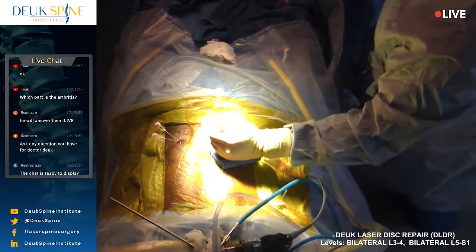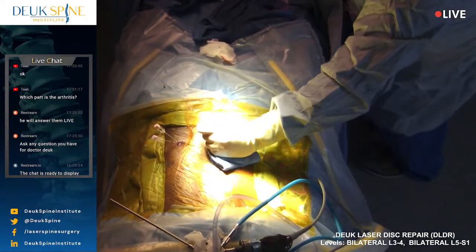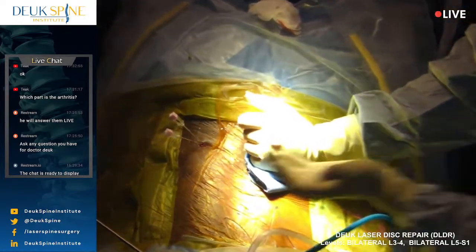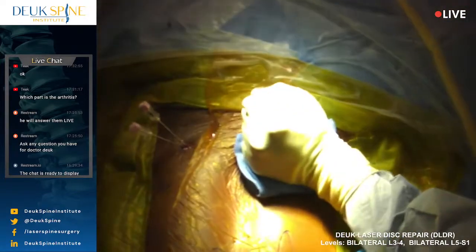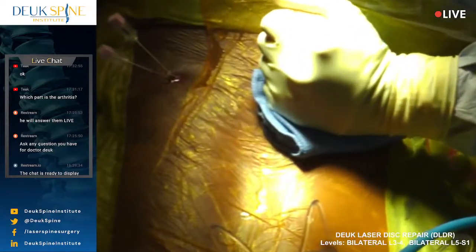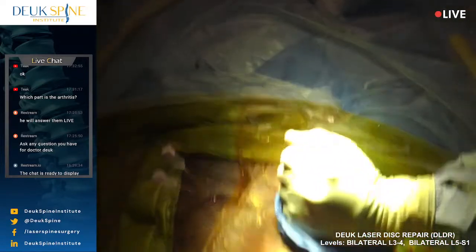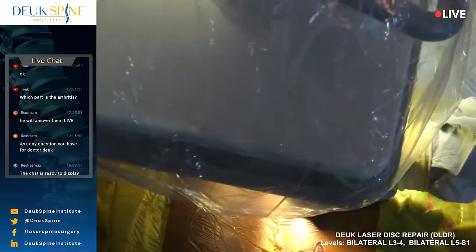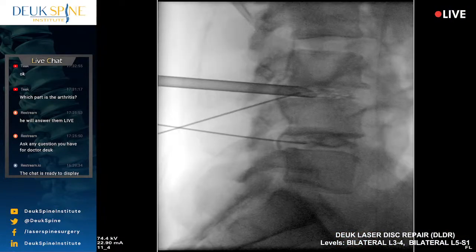So I'm putting a little pressure on the muscle. You always want to put pressure on the muscle when you take the tube out because it could bleed a little bit. And just a little bit of pressure. All you need is 10 millimeters of mercury, as long as the patient doesn't have venous hypertension, right? But 10 millimeters, 12 millimeters of pressure keeps any blood from the veins from coming out, and it basically keeps the muscles from being inflamed.